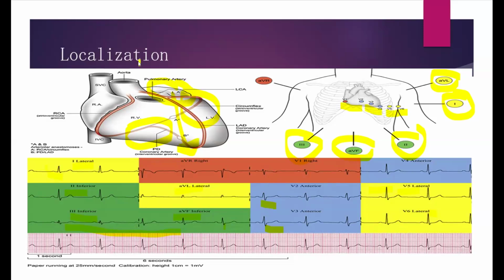All right, so the first one: how do we define a ventricular hypertrophy in ECG? If I were to go into that, it would go longer. So for right ventricular hypertrophy, you're looking at V1, V2. Instead of having a predominant S wave in V1 and V2, you have a predominant R wave. So that points towards a right ventricular hypertrophy.